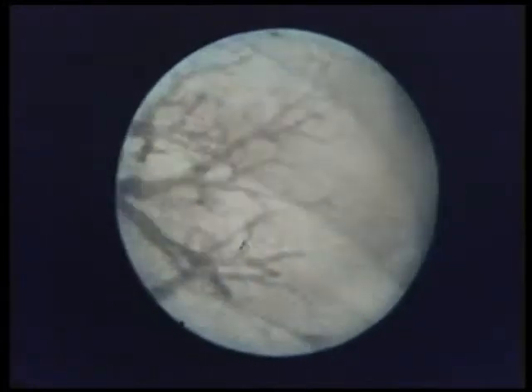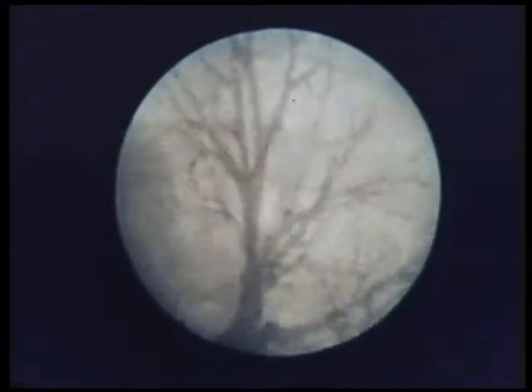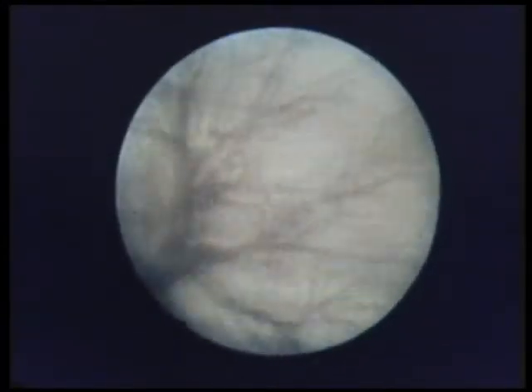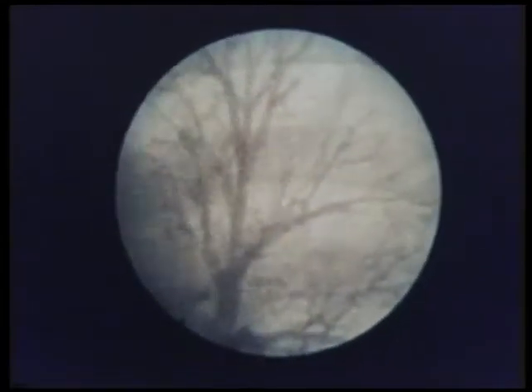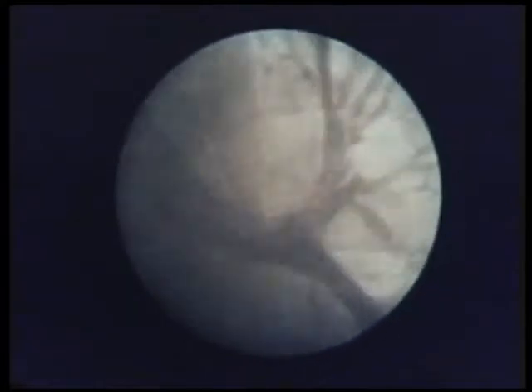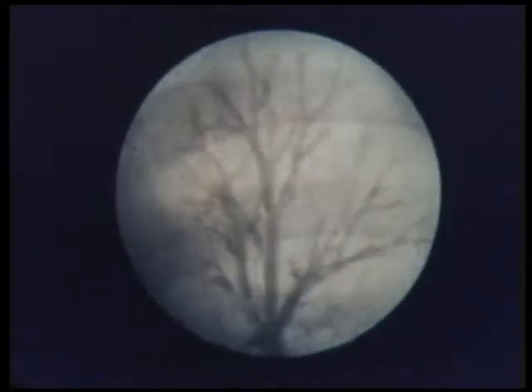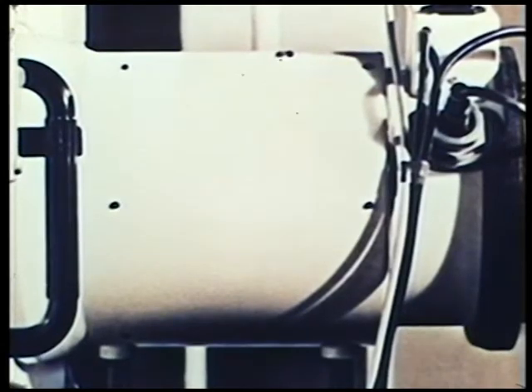The contrast medium has filled the upper lobe bronchus, the main bronchus, and the lower lobe bronchus. All these bronchi can be seen clearly as far as the periphery. Slow rotation of the patient gives a stereoscopic impression in a normal bronchial tree. These X-ray pictures, which can also be used for observing the course of the examination, were taken by using an image converter. This can be mounted on a screening apparatus.